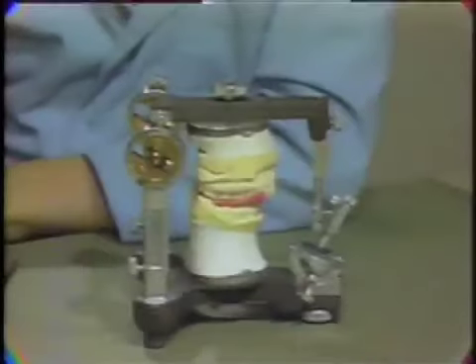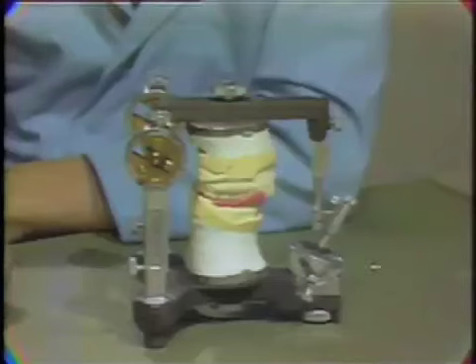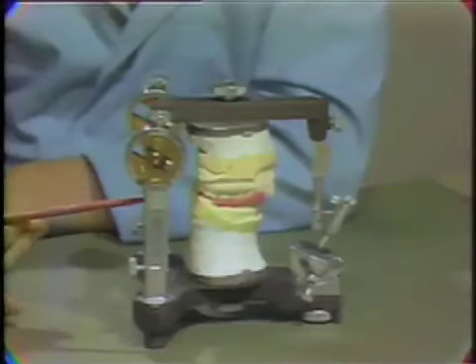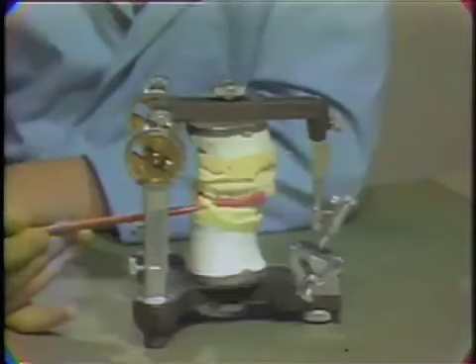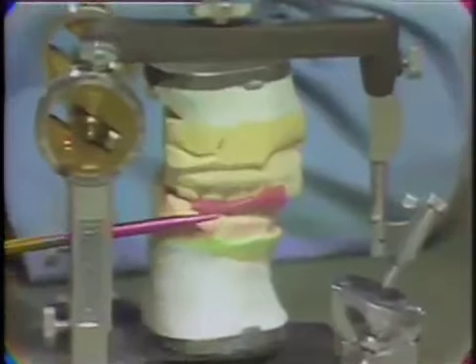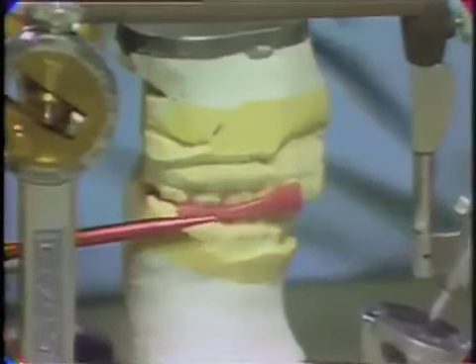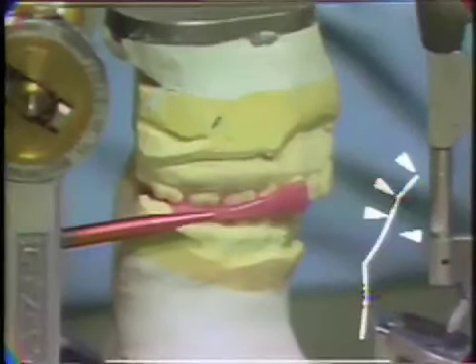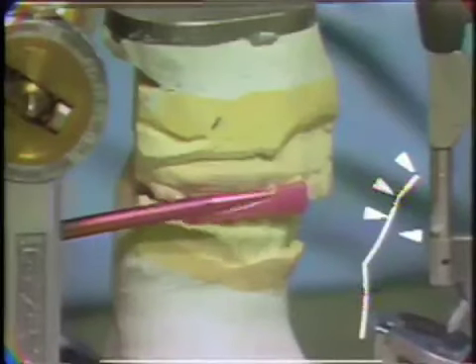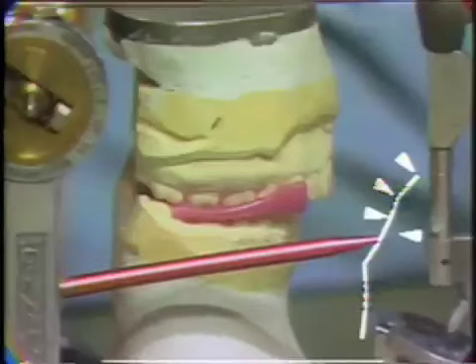The centric relation registration is used to mount the lower cast in relationship to the maxillary cast that is mounted on the articulator in relationship to the hinge axis. The teeth are separated, and we must take the centric relation registration from between the teeth and close the teeth down into contact, and we would hope we'd have the same centric contact.